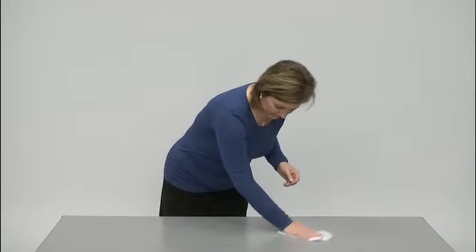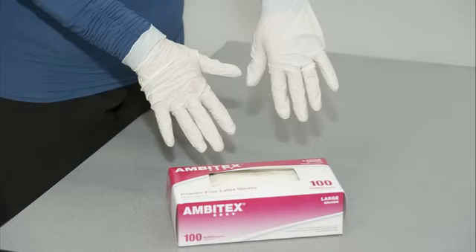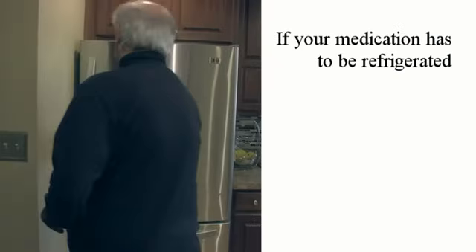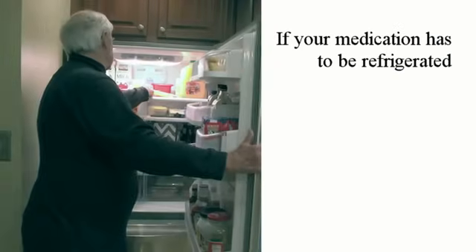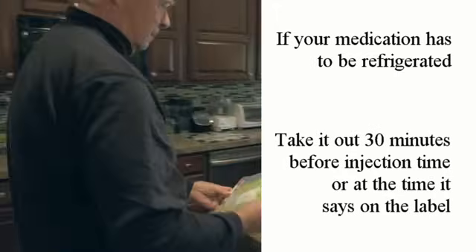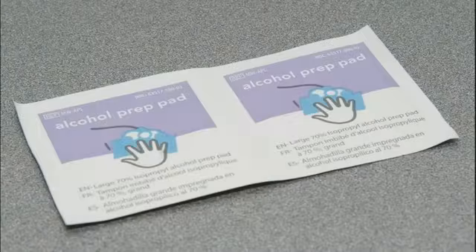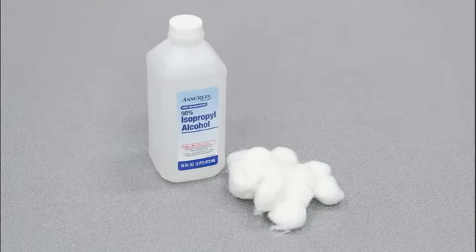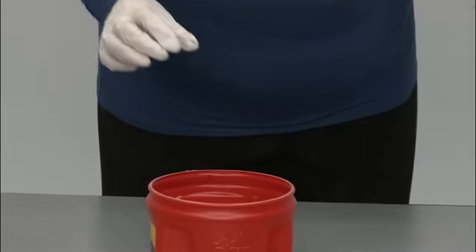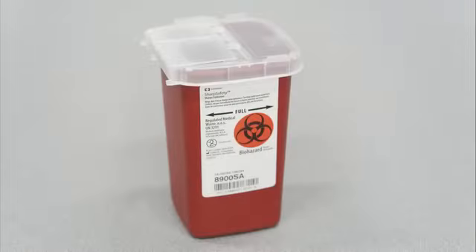Select a clean, dry work area and gather the following supplies: disposable gloves if you are giving the injection to someone else; a pre-filled syringe of chemotherapy. Please note that if your medication has to be refrigerated, take it out of the refrigerator 30 minutes before your injection time or at the time it says on the label. The needle that has been prescribed for these injections; two alcohol wipes — you can also use cotton balls and a bottle of rubbing alcohol; a bandage; and a container for used equipment. You can use a hard plastic or metal container with a screw-on or tight lid, or a commercial sharps container.